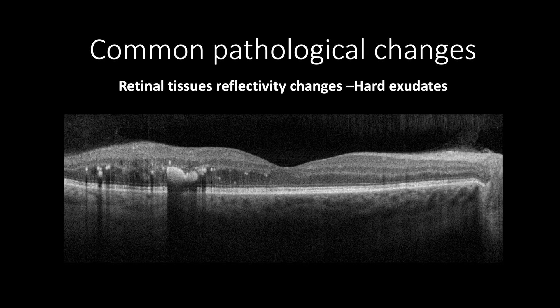This is a case of non-central diabetic macular edema with hard exudates presented as hyperreflective masses with different sizes. They are located in the outer retinal tissue casting shadow artifact, causing hyporeflectivity of the underlying retinal tissues. In contrast, the adjacent hyperreflective dots don't cast any shadow.